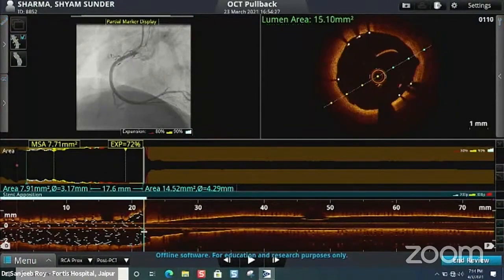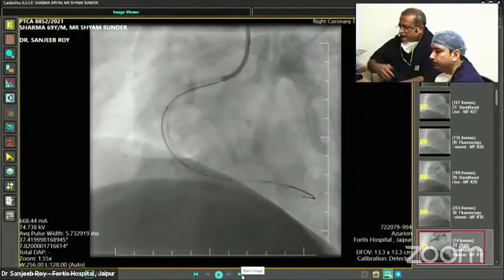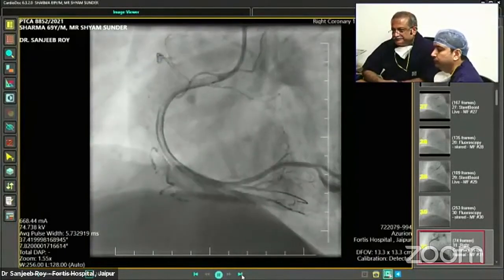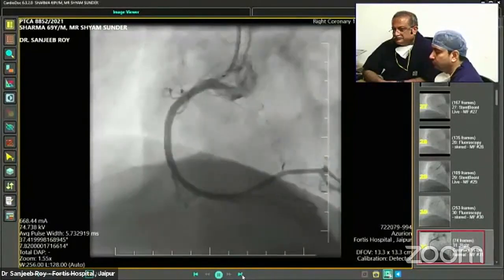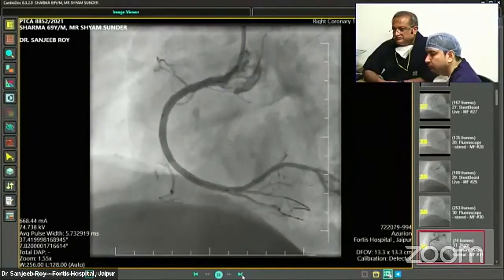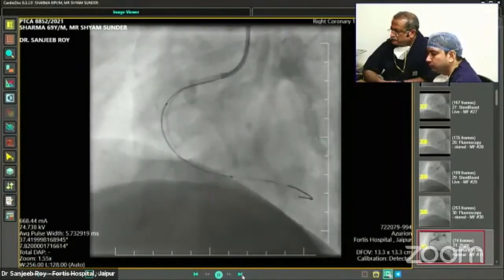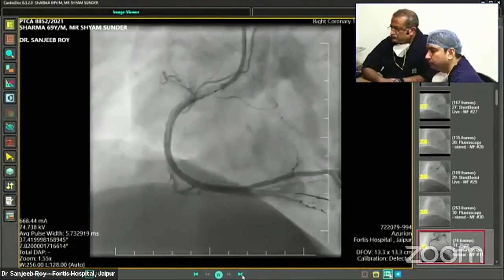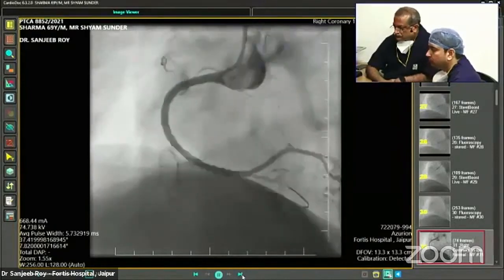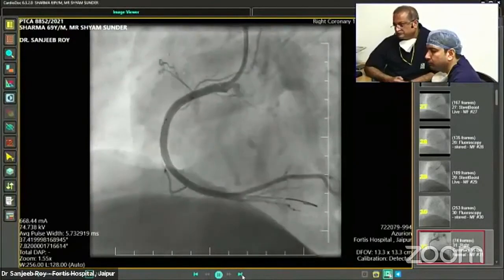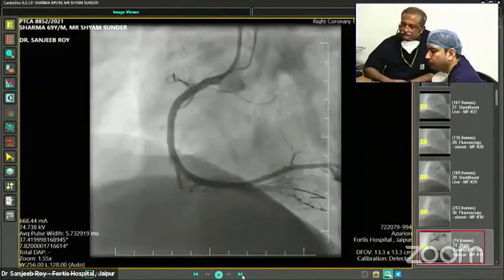The angiographic result looks excellent. A key takeaway from this case: many times we underappreciate the distal vessel caliber until the proximal obstruction is treated. What appears to be a 2-2.25 mm vessel on angiography can measure 3-3.5 mm on OCT — for the last three right coronary CTOs, imaging revealed vessels measuring 4 mm where angiography suggested only 2.25 mm. Imaging makes a dramatic difference in stent sizing.